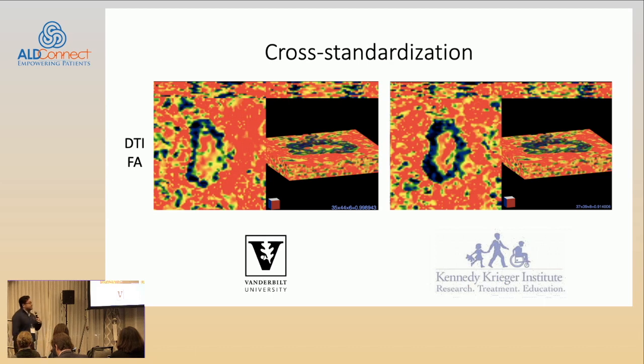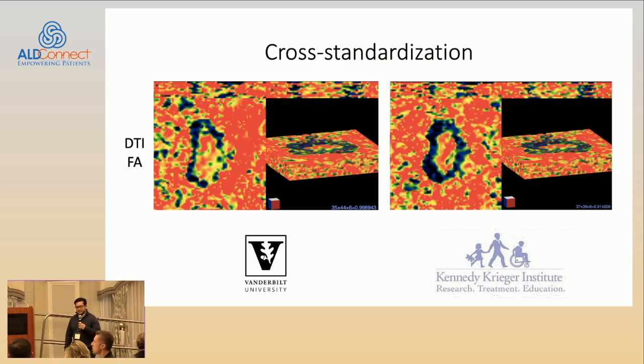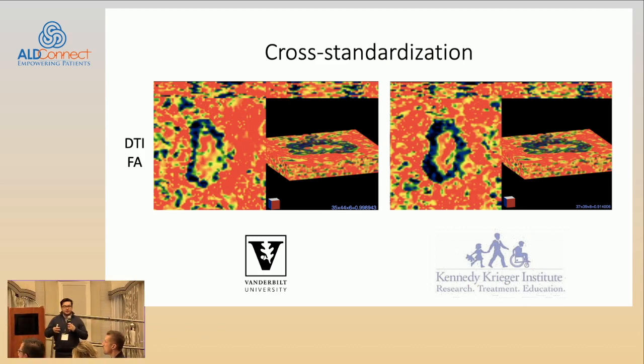We're also doing these advanced DTI sequences. One of them is called NODDI. Just showing the raw numbers would not really mean anything. What it is showing is mathematically modeling the individual neurites, the processes sprouting out of those long nerves in the spinal cord.